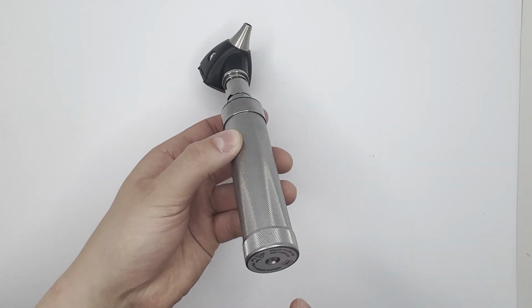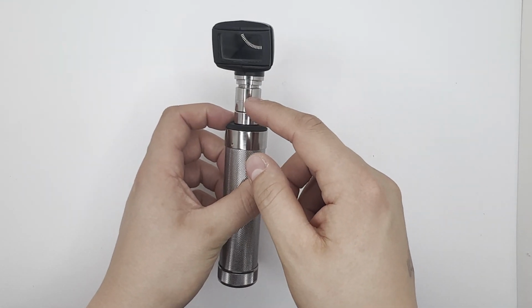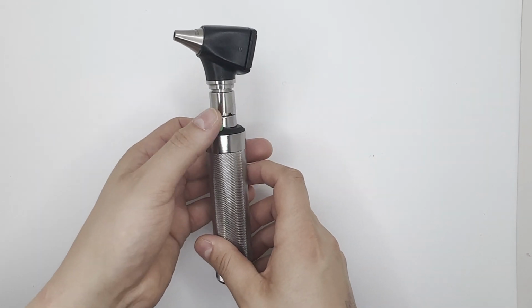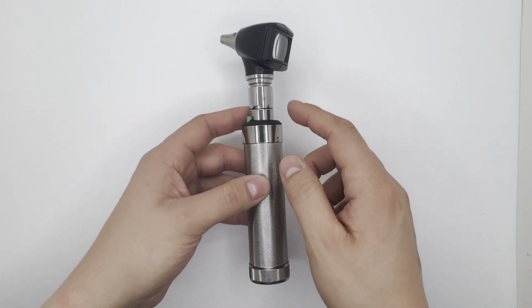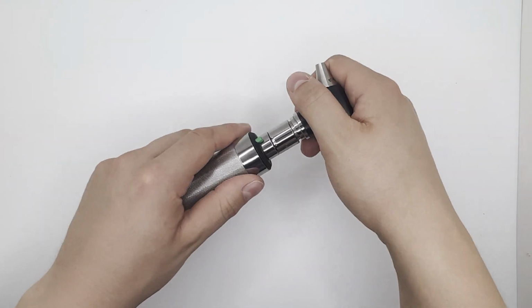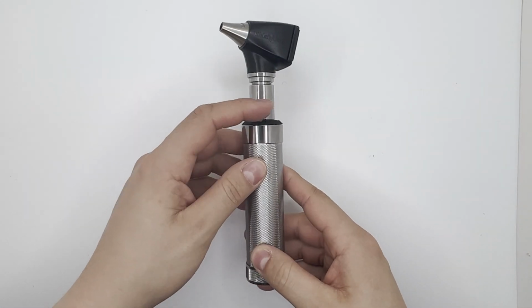Depending on the model, scopes can be powered by disposable batteries, rechargeable batteries, or a wall plug. The handle of non-corded scopes contains the battery, the light source, and the power switch. Mirrors direct the light from the bulb to the head of the scope. The head of the scope twists onto the handle. The light intensity of the scope is adjusted with a collar at the top of the handle.